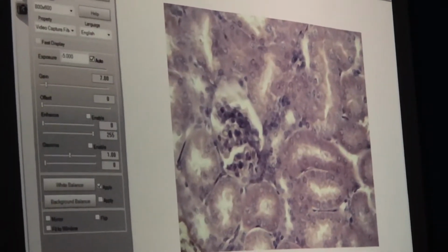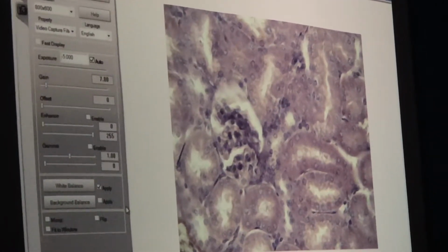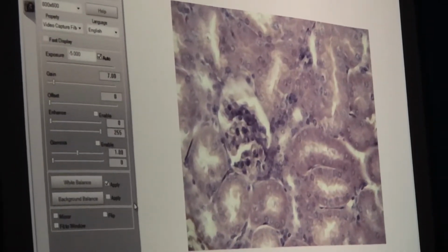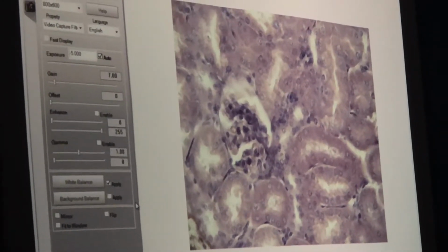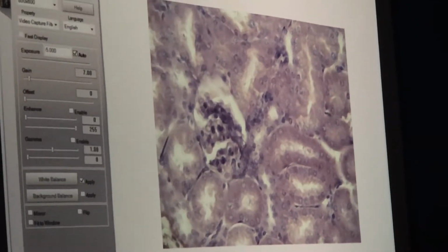Okay, so I picked this little spot right here because when I'm looking for an arteriole, by the way, I'm not going to be able to tell if they're afferent or efferent. First of all, I'm probably not going to have both of them there to compare size. And second of all, this is a static thing, so I can't see which way the blood is flowing. So for arteriole, if you wanted to put afferent or efferent arteriole, that works as well.